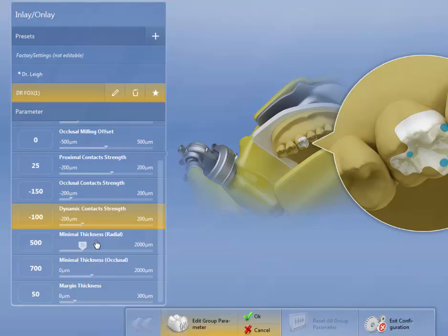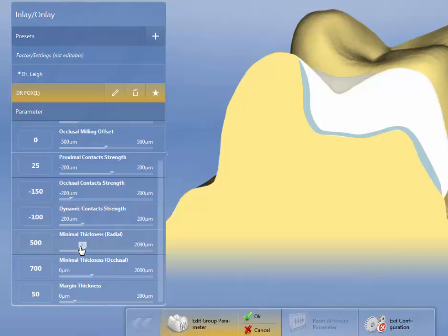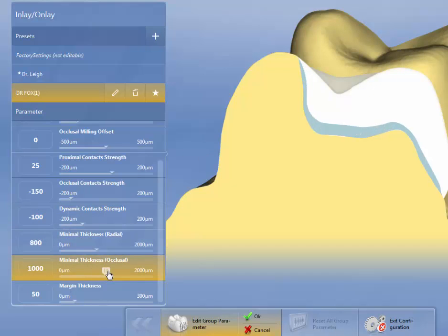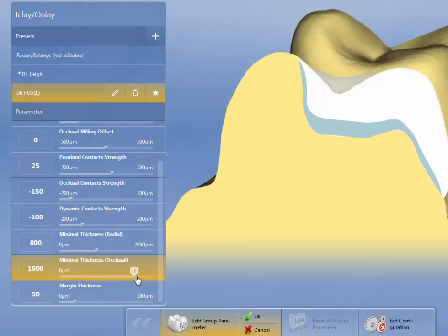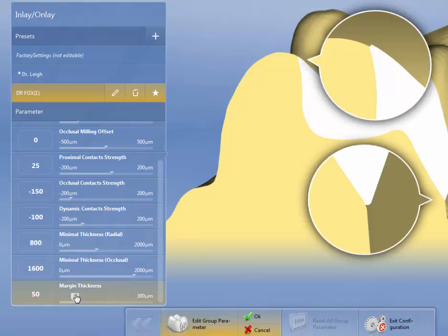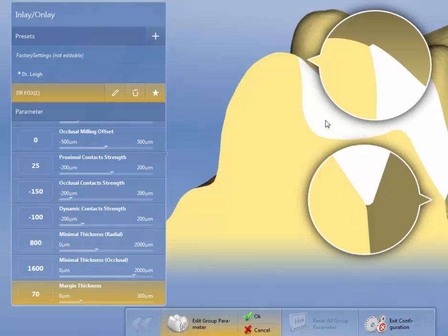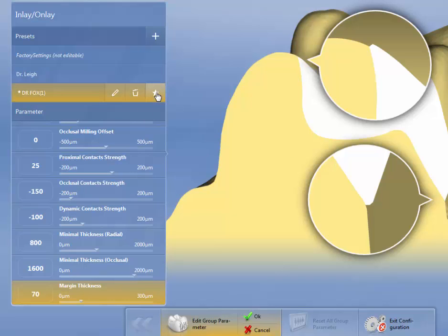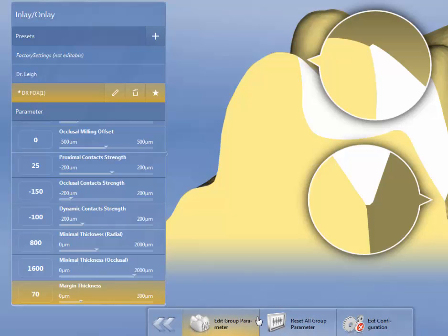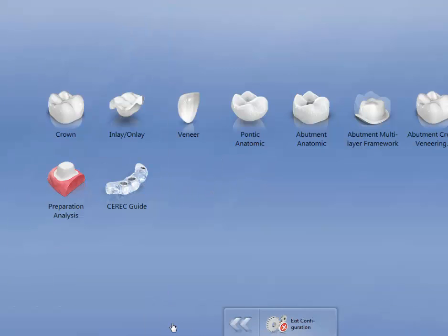Minimal thickness radial, again I'm going to turn that to 800. And minimal thickness for occlusal, which is more important, we're going to go to 1600. And then margin thickness, I'm going to increase this to 70. And this will only be where it's not on an interproximal margin. Once I'm finished with that, I'm going to again hit the default sign, and then I'm going to hit OK. Go backwards.